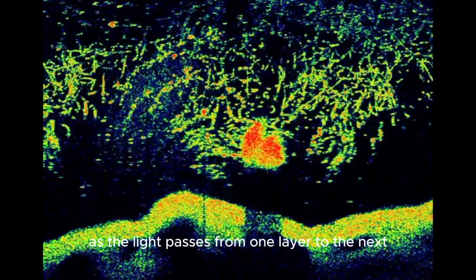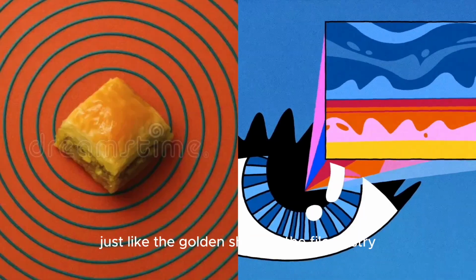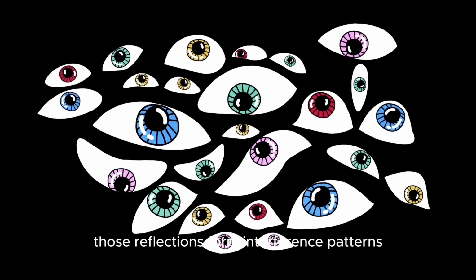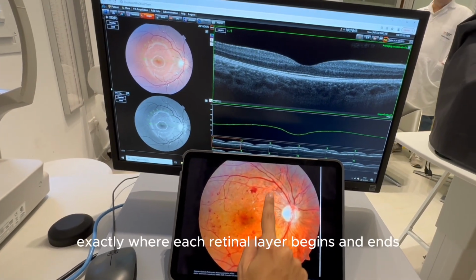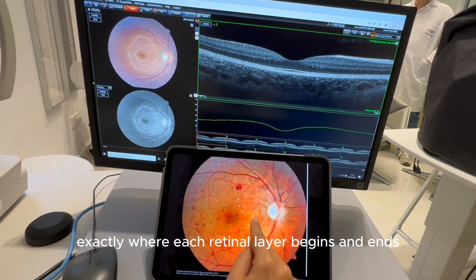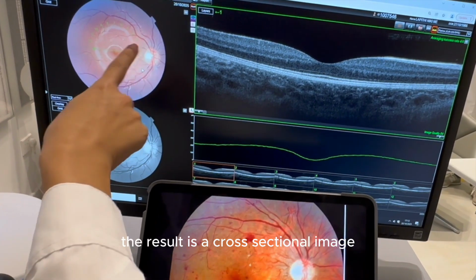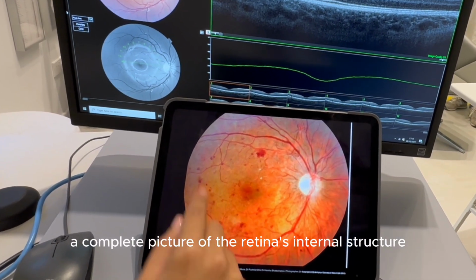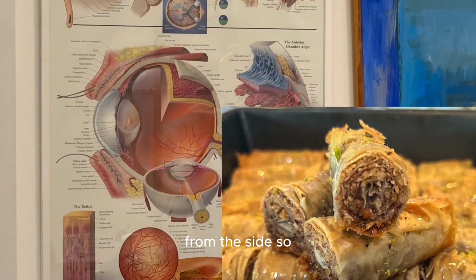As the light passes from one layer to the next, some of it reflects, just like the golden shine of the phyllo pastry. Those reflections form interference patterns, which the OCT machine decodes to find exactly where each retinal layer begins and ends. The result is a cross-sectional image, a B-scan, a complete picture of the retina's internal structure, as if you could see all of the baklava layers from the side.